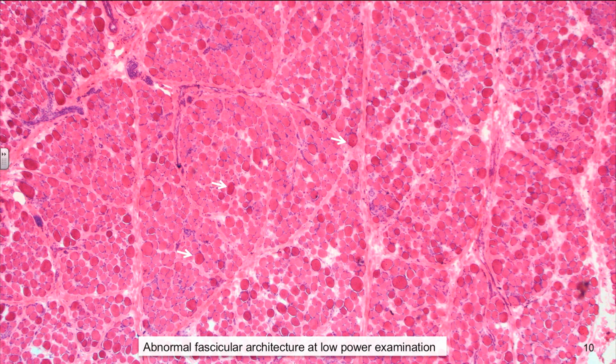A muscle biopsy was done, and here is what we see in the skeletal muscle biopsy of this 3-year-old boy. Now you have to know that when biopsies are coming from kids, their muscle biopsy may not necessarily by size be like an adult, so we have to adjust our eyes. They're quite good looking myofibers compared to adult, not as big but not very, very small. This muscle biopsy shows myofibers that are very small.